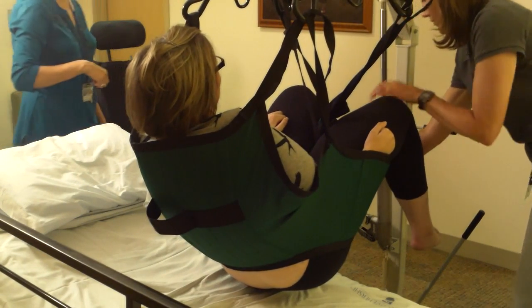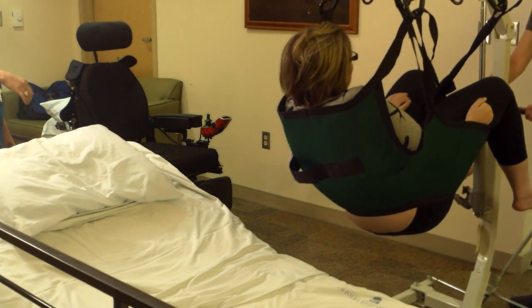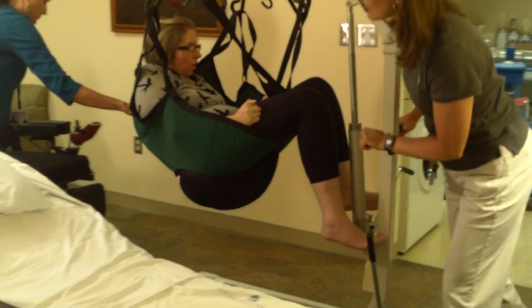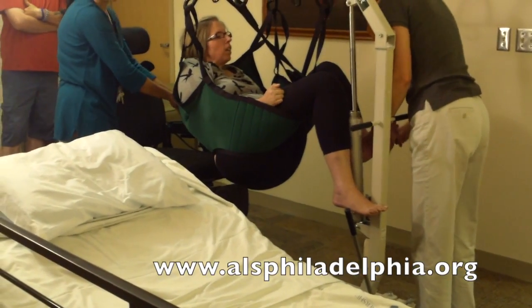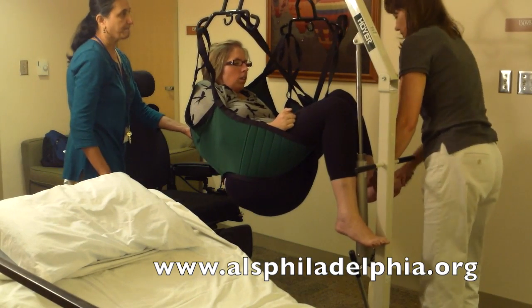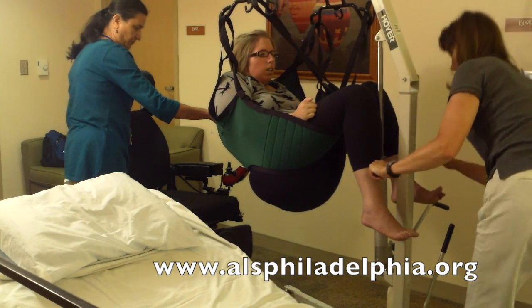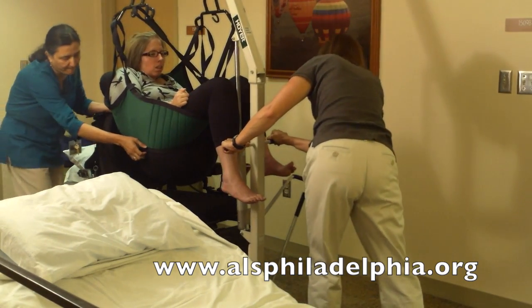Pull the Hoyer lift out and turn the patient so that she is facing the lift. Before you position in front of the wheelchair, you may have to raise the patient a little higher in case their wheelchair is at a higher level. It helps if the wheelchair is tilted for better positioning of the patient. Make sure you spread the legs of the Hoyer lift, move it around the wheelchair, and lock it in place.